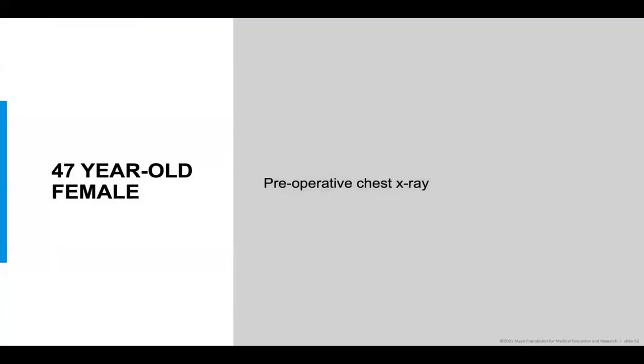Regarding the phase imaging, what plane are the images acquired in? We had that question in the chat. So to quantify the amount of flow through a vessel or through a valve, you want your plane to be orthogonal to the direction of flow.